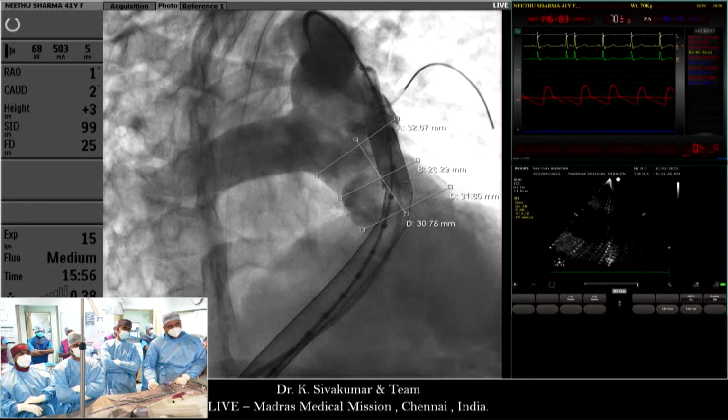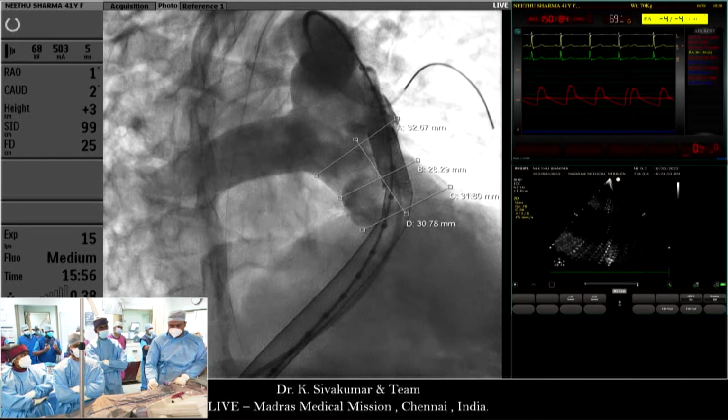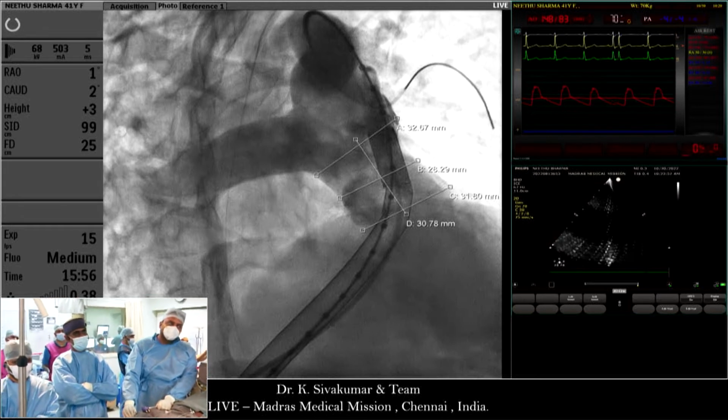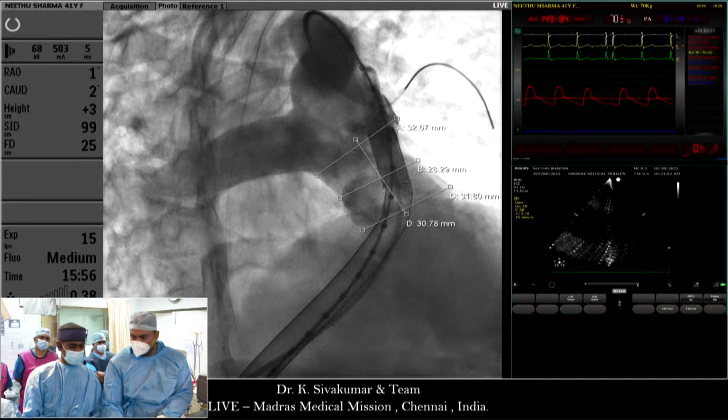So this is 33 at the distal, 28 at the mid portion, 32 at the proximal. We have in all the places around 31 millimeter length. I am now free to take your questions.